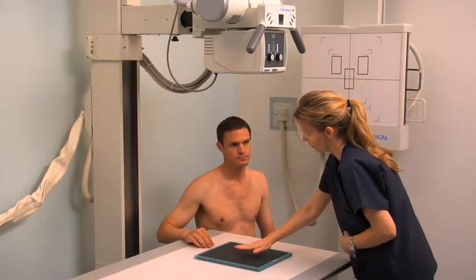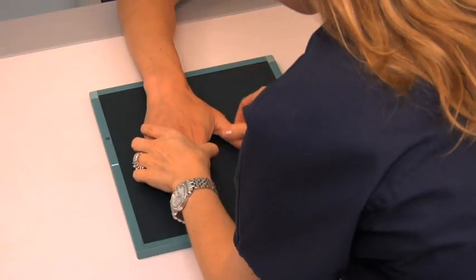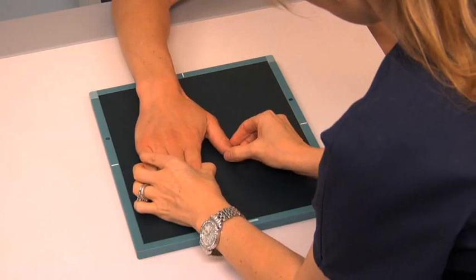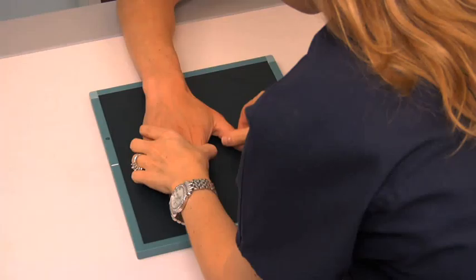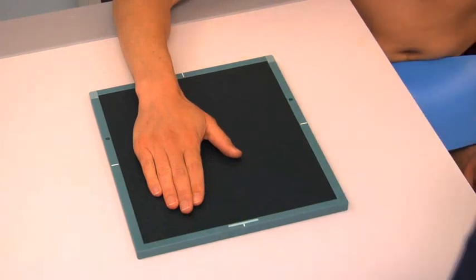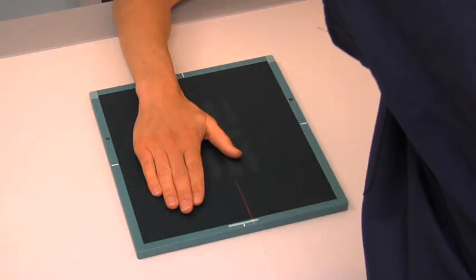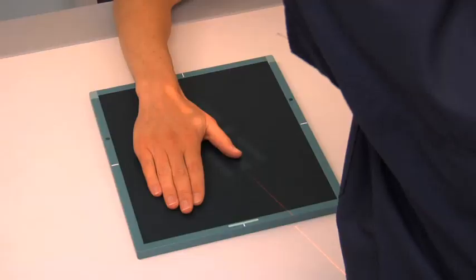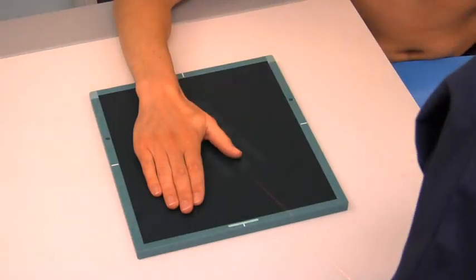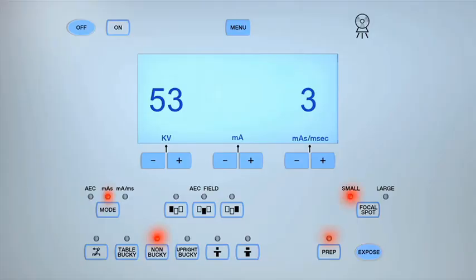To obtain an oblique projection of the thumb, ask the patient to place their hand palm down with their thumb abducted on a second 8-by-10-inch cassette. Align their thumb with the center of the cassette. Ulnar deviation may be applied to the wrist to extend other fingers out of the way. Center the central ray to the MCP joint. Collimate the light field the same as for the AP thumb projection and expose the cassette.